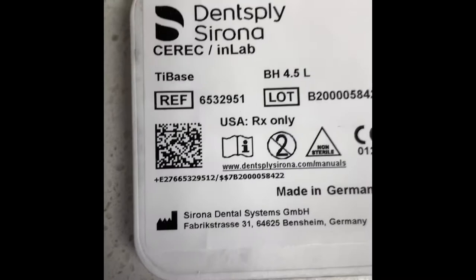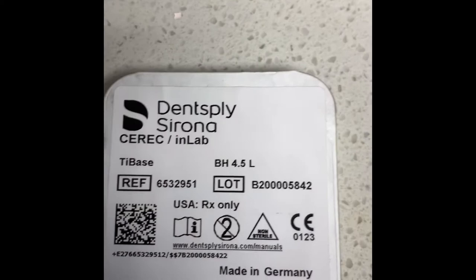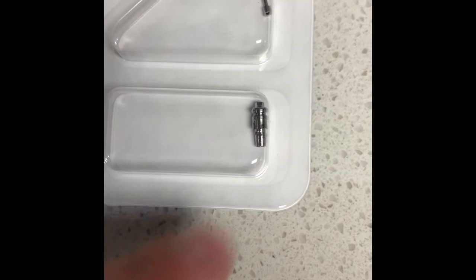When you have the tie base, you're going to put a scan body right on top. This is how the CEREC software kind of reads it, so it just goes right on top of there. If it's too low and you can't see the scan body, that's where scan posts come into place. This is a scan post for the same tie base, and it's got the same top, but you can see it's a little bit longer — it's kind of elevated. So then you still put the scan body on top so that you can scan it.